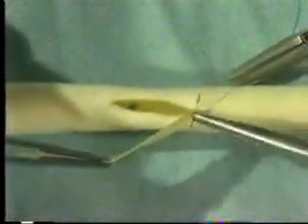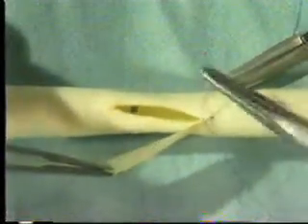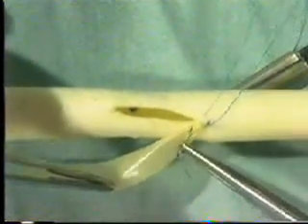Place one end in a rubber-shod hemostat, then using the free end of the suture, work down the far side of the arteriotomy from outside to inside on the graft and then inside to outside on the artery. Try to ensure that the vein patch is bedded down by holding the surface portion of the patch with your forceps.